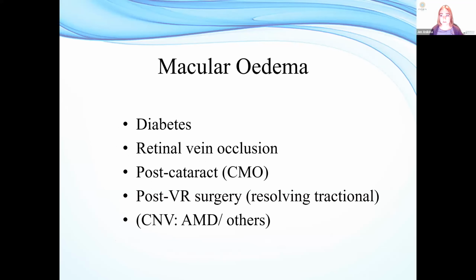I've put in post-VR surgery because obviously I'm a VR surgeon, it's a special interest, because I see these patients referred to me, and I'll show you what I mean later about what that means. And also, you know, there can be edema in other conditions.